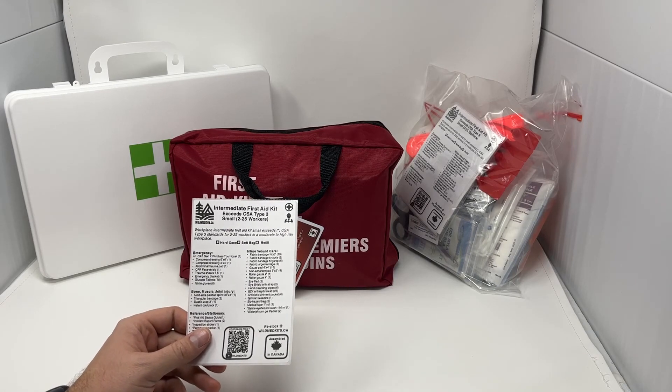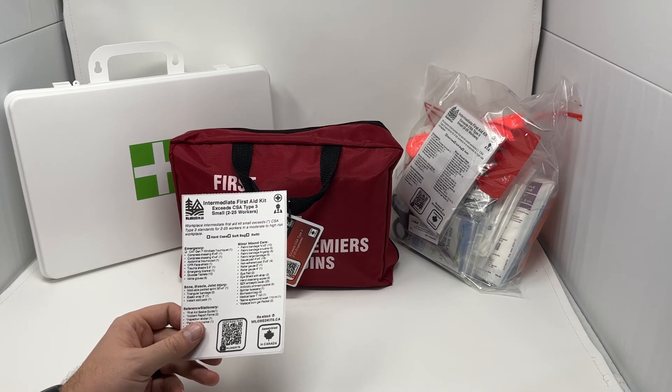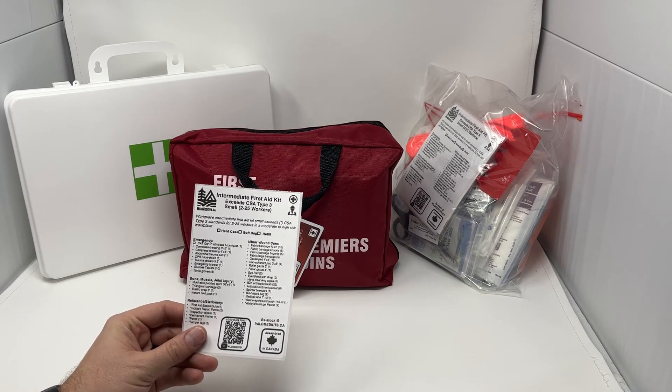This is an overview of our CSA Type 3 Intermediate First Aid Kits. These exceed the CSA guidelines for Workplace First Aid Kits in Canada.